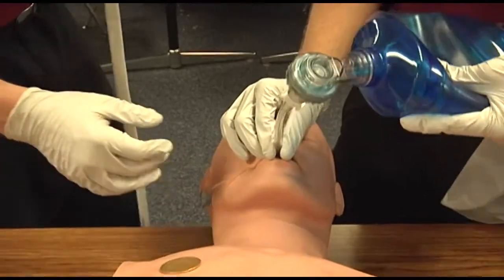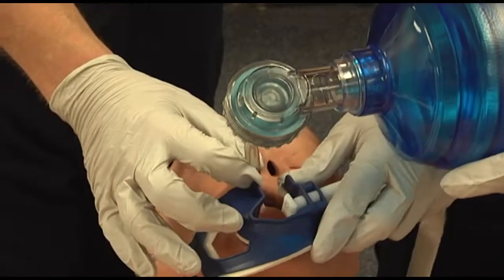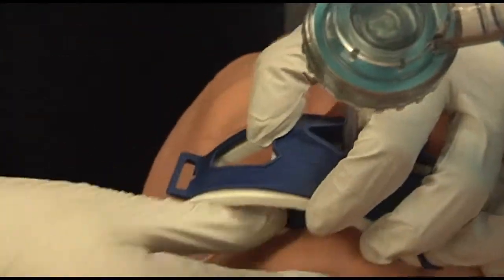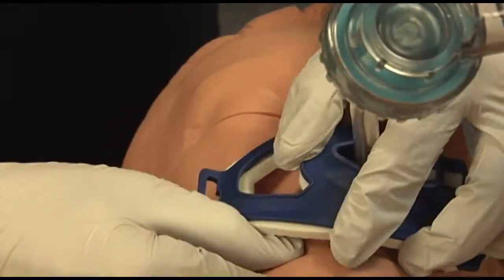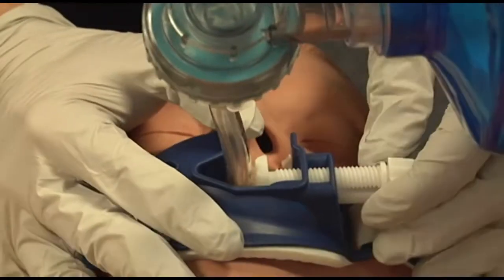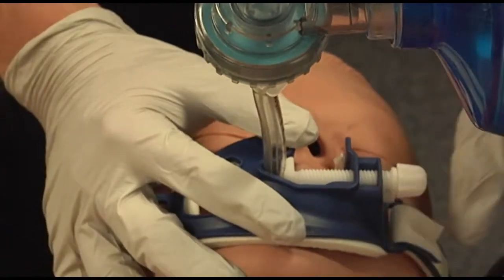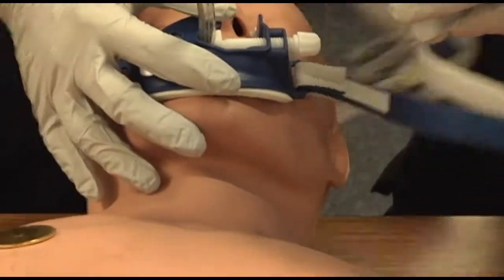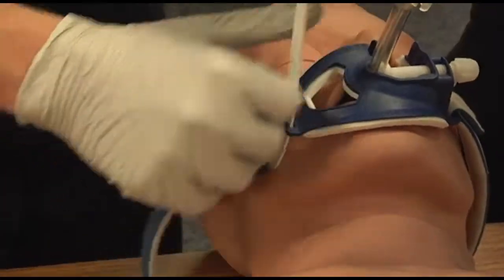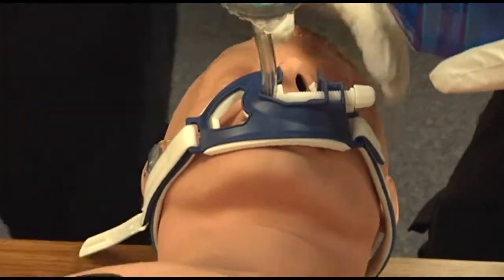Confirm proper placement by auscultation over the epigastric and lung areas. You should have no epigastric sounds and bilateral lung sounds present. Secure the ET tube with tape or a commercial device, and a C-collar may be placed at this time while maintaining in-line C-spine stabilization.